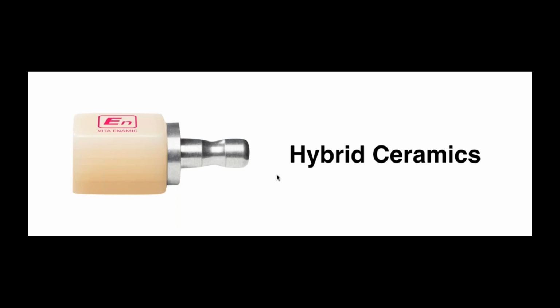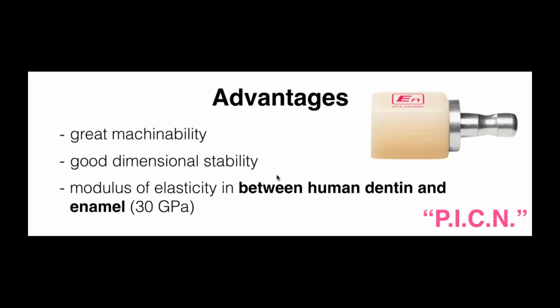So here, it's also important to consider the minimal thickness when we are designing, for two reasons. One, to maintain the ideal thickness for flexural strength, and also have certain thickness for masking the titanium components. So if you have very reduced restorative space, I might be changing my decision and going for a zirconia that I can mask a tie base and work it safely in a thinner dimension at that cervical area, okay? So it's important that as clinicians, we understand this rationale to select the material the best we can.